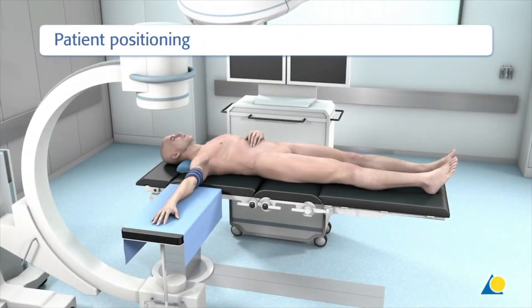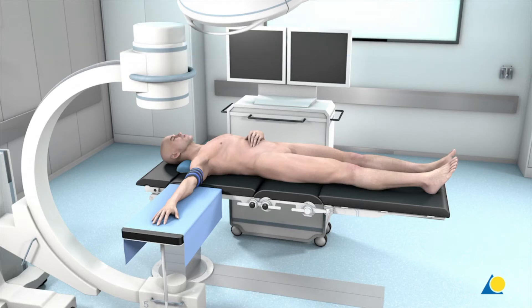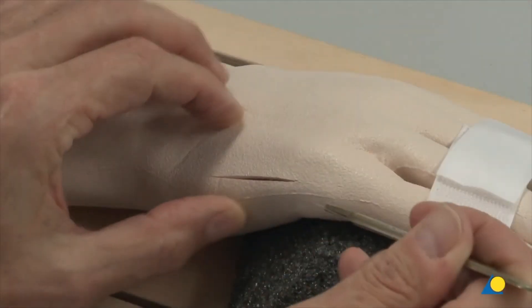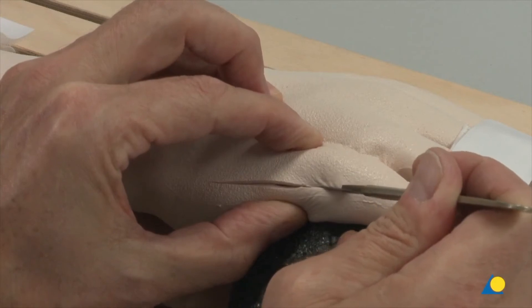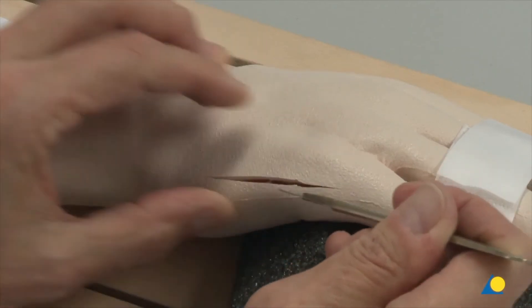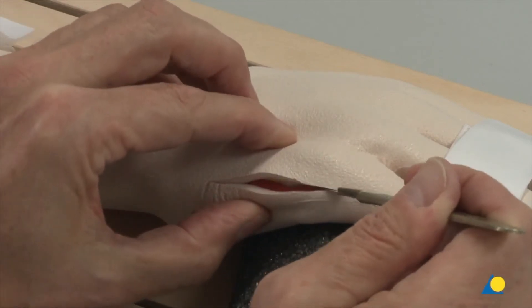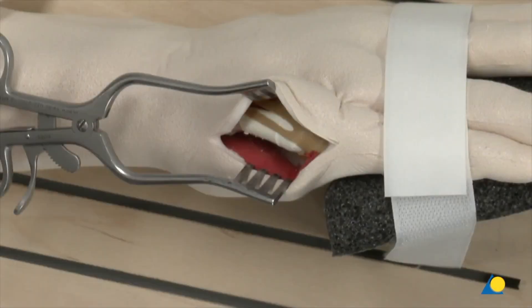The patient is positioned supine on the operating table with the arm placed on an arm table at the level of the shoulder joint. The use of a tourniquet is strongly recommended. A fluoroscope is positioned opposite the surgeon to allow intraoperative radiological examination. The approach to the neck of the fifth metacarpal is dorsal ulnar. The dorsal sensory branch of the ulnar nerve has to be carefully protected and is secured with self-retaining retractors.